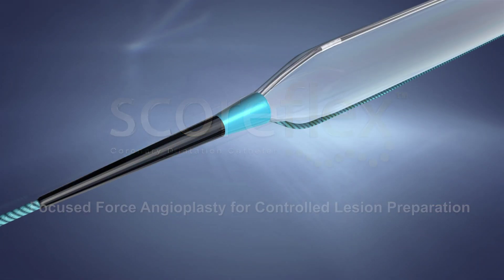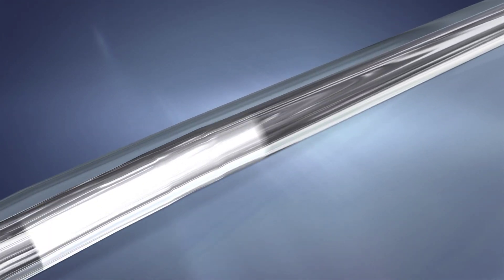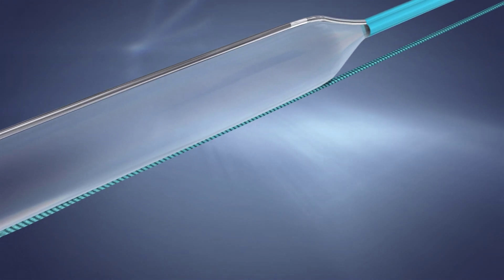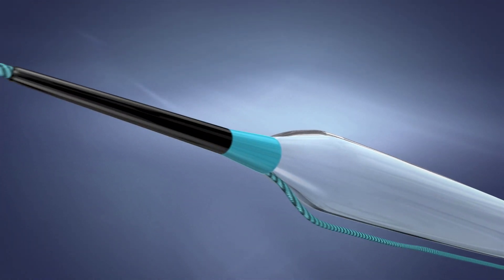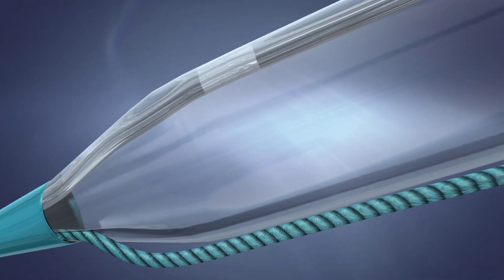SCOREflex is a dual wire system. The first wire, the integral wire of the SCOREflex system, is mounted from the distal tip to the proximal end of the balloon. This wire is made of nitinol. The second wire, the 0.014 inch guide wire, runs on a mini rail system to where the exit port is distal to the balloon.